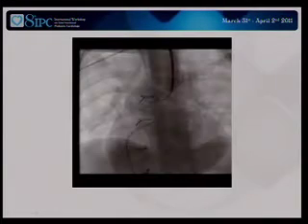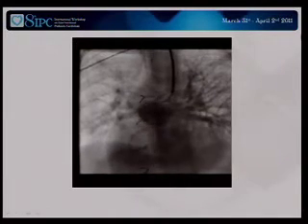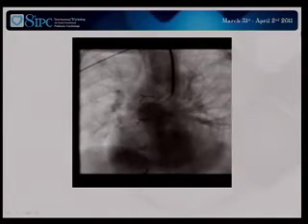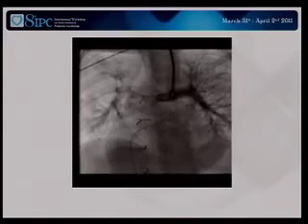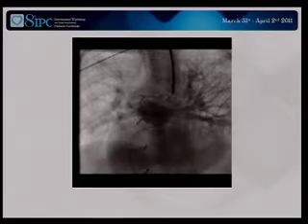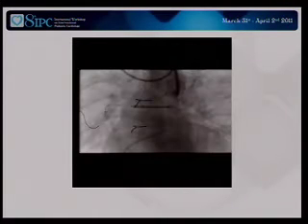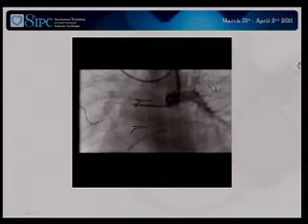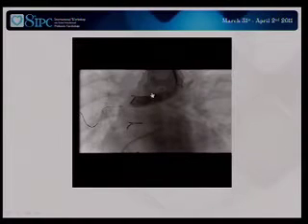The pressures then were 20 after the procedure, 20 as a mean pressure in the pulmonary arteries, and about 10 in the right atrium. So we ended the procedure at that time, and we planned this cath for today. During that time, there were no changes in patient conditions. His saturation is almost the same. It's between 81 and 84.